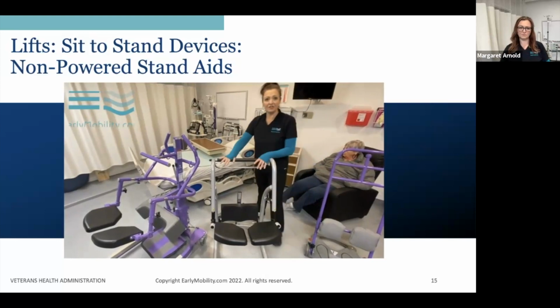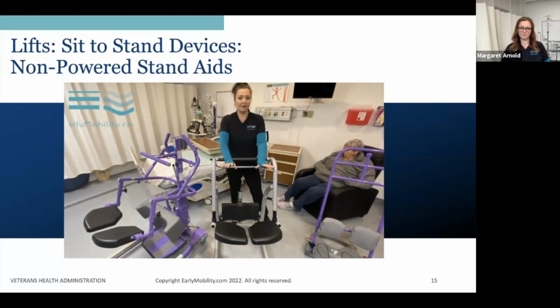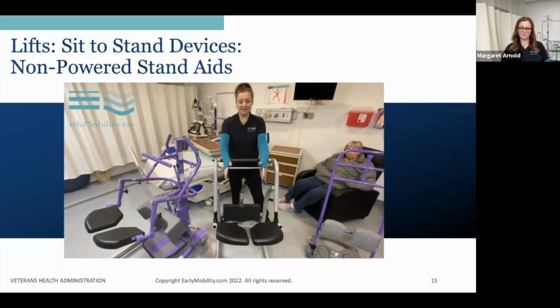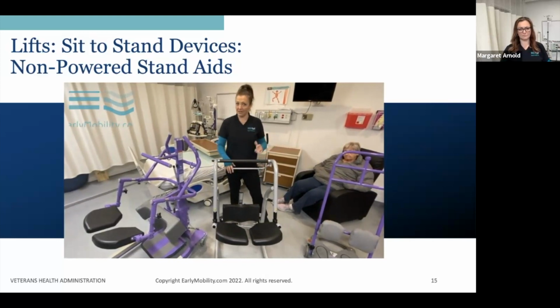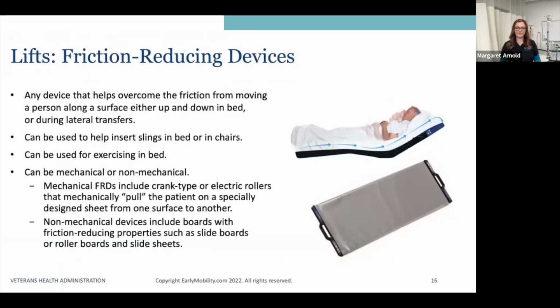The advantage of that is that if the patient needs to sit, they can sit on the support and be transported back to where they need to go. So lots of different features of the lifts for you to consider ahead of purchasing. And when you do equipment fairs, you can perhaps put checklists together of the features that your team likes the best or work the best in your unit.